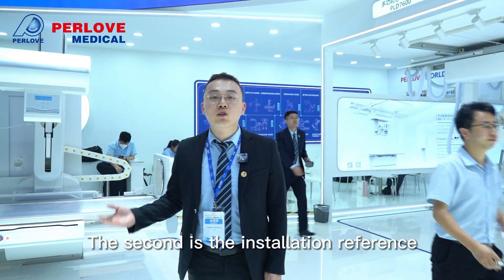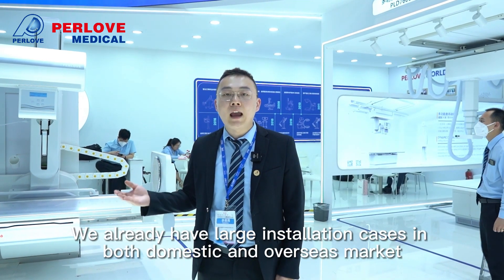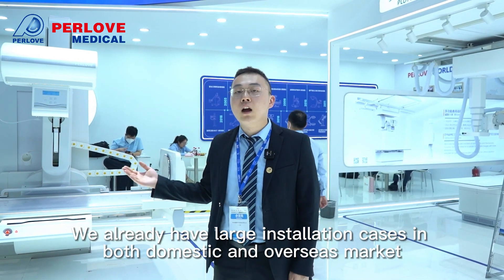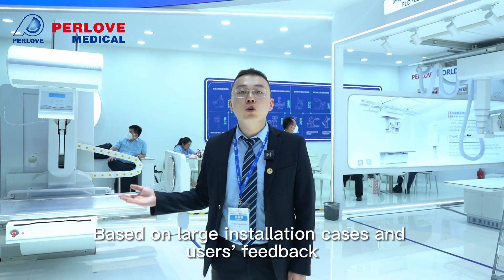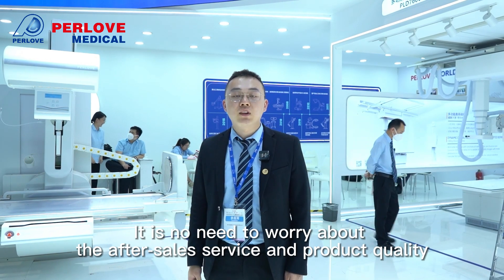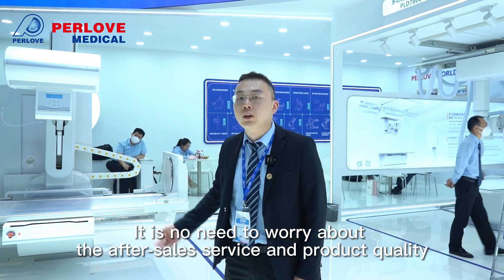The second key point is installation reference. We already have a large number of installation cases in both the domestic and overseas markets. Based on these large installation cases and user feedback, there is no need to worry about after-sales service or product quality.